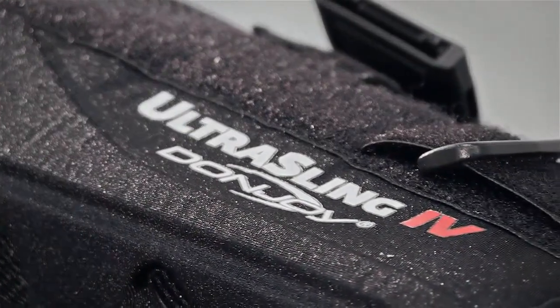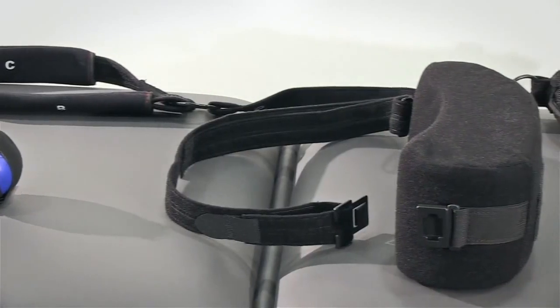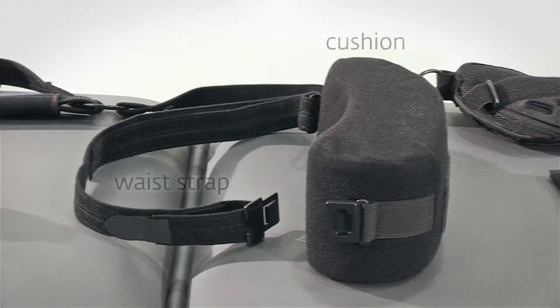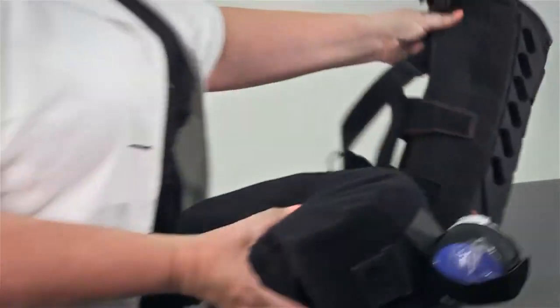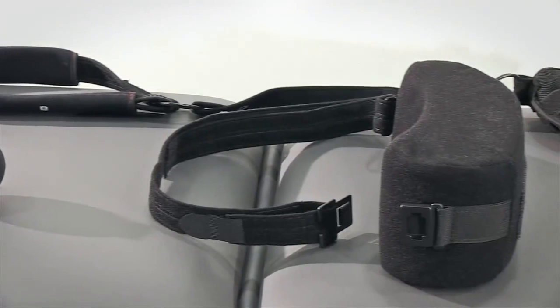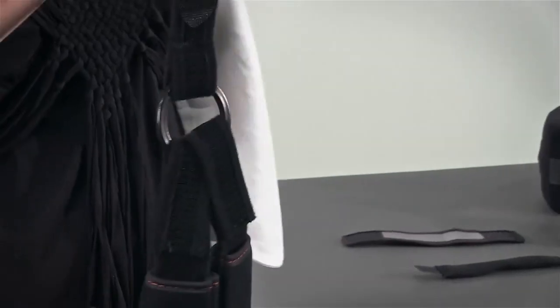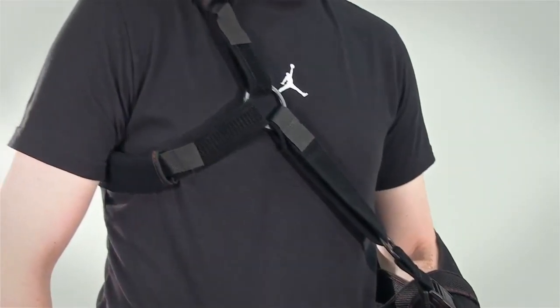Before we demonstrate how to fit the Donjoy Ultra Sling 4, we'll run through the various components which make up this product. There is a cushion and waist strap. The sling is attached to the cushion with Velcro. The shoulder strap attaches to the sling, and you can tell the difference between this and the waist strap as it has two rings and a double padded strap which protects the neck.